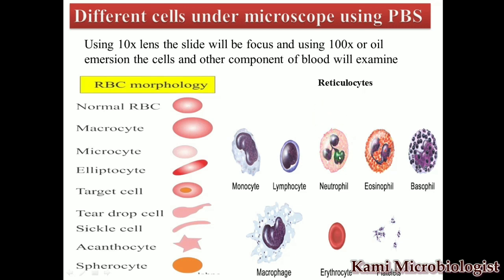So the neutrophil will look like this form. This is the structure of the eosinophil under the microscope. Its nucleus is mostly spectacle-shaped, meaning two lobes, and they also have granules. If we talk about the basophils, the basophil's nucleus will be hidden behind the granules, as you can see.